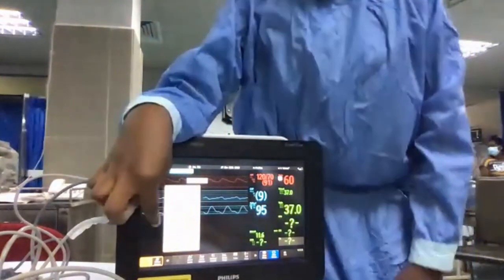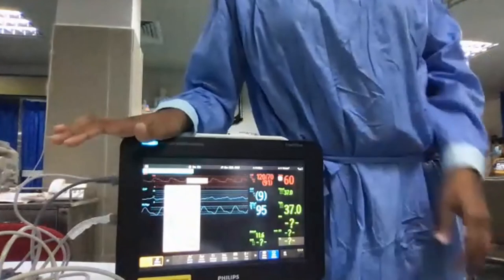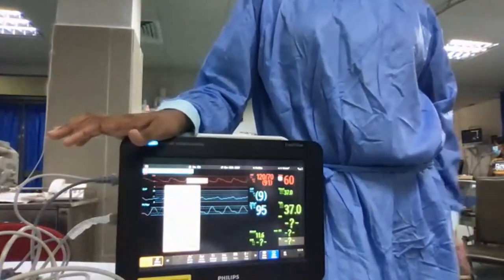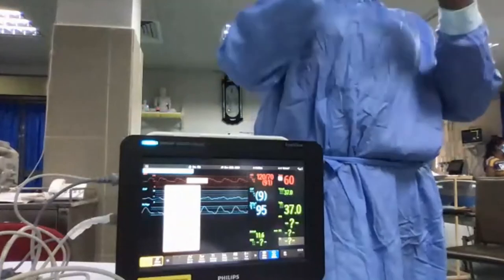No, don't worry about that. I will ask Nalaka to upgrade it into the PiCCO screen. I will show you that screen, madam. On that screen, we will have the PiCCO regions as well as the IBP and the central line. It will be categorized as preload, afterload, and contractility. You will get the categories like that.